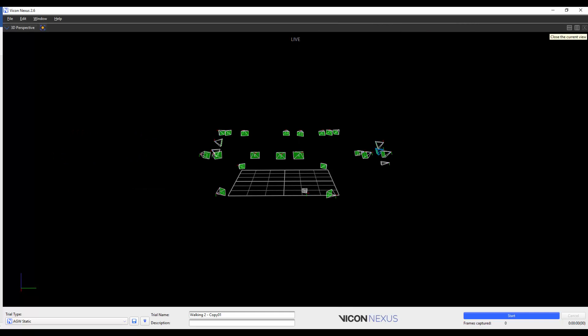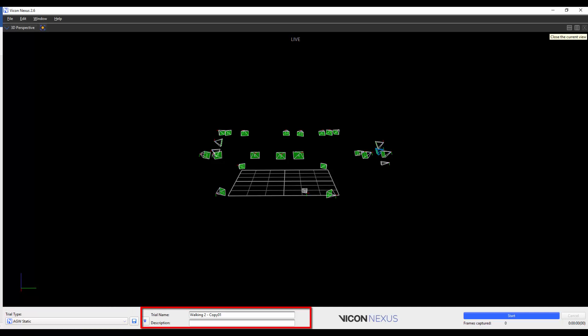Once you're in the Simple Capture Mode, you can select a trial type if you wish, change the trial name and description, and start and stop captures.